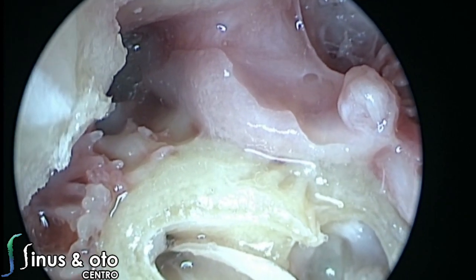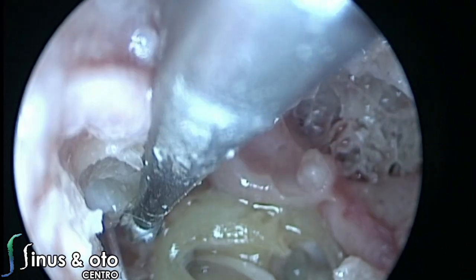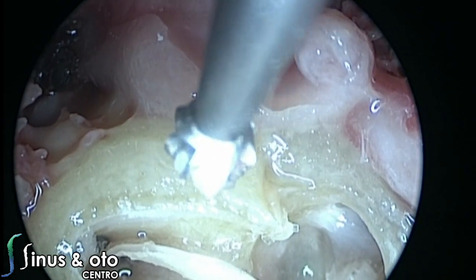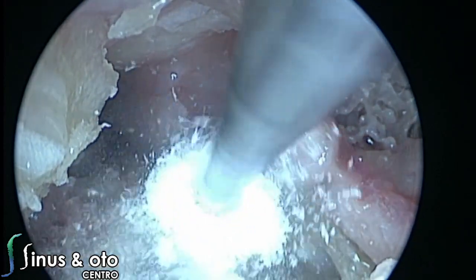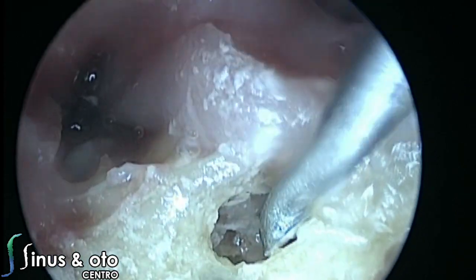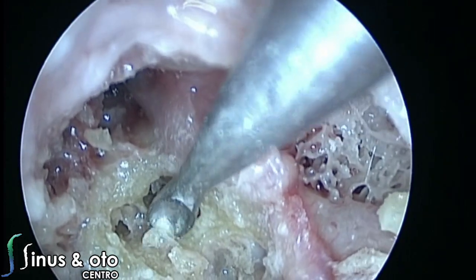The next step in this dissection is to demonstrate the anatomy and try to open a little bit more the superior part of the cochlea to see the middle turn and also the apical turn of the cochlea. If we draw a line between the cochleariform process, which is a little bit more to the right, and the carotid artery, in the middle between these structures we start to drill, and then we can see the middle and most apical turn of the cochlea, also trying to delineate the modiolus and to see the scala vestibuli and the scala tympani inside the cochlea.